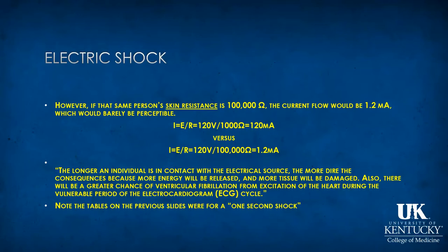Getting back to the statement about resistance, if a person's skin had a very high resistance, it was not moist or wet, or if there's some sort of electrical insulation, well, the amount of current that would flow into the person at risk would be relatively small, like 1.2 milliamps, which would be barely perceptible. However, if the resistance were lower, a much larger amount of current would flow into this person at risk.